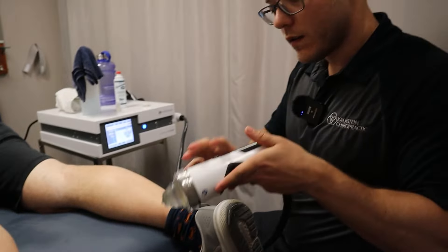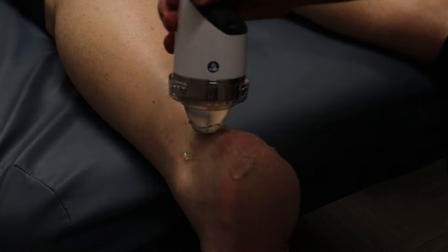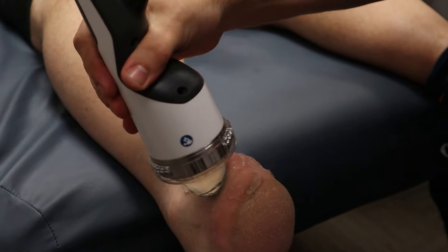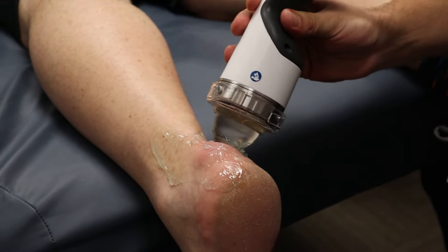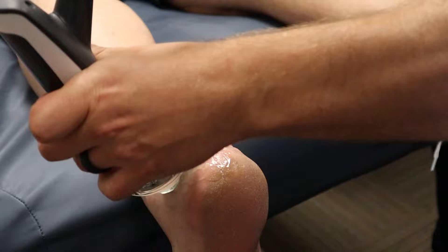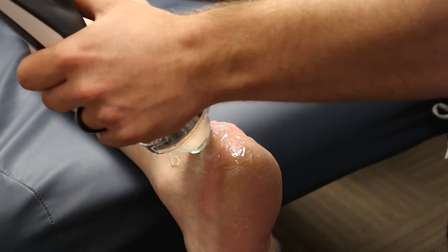This is just to showcase another form of treatment that we can do with our new Focused Shockwave. We have tons of Achilles and plantar fascia, a lot of hip, a lot of shoulder, and all of those will be treated with the Focus Shockwave. We're going to document them with videos to really spread the knowledge of Focus Shockwave and what we can treat with it. Let's go ahead and get started.